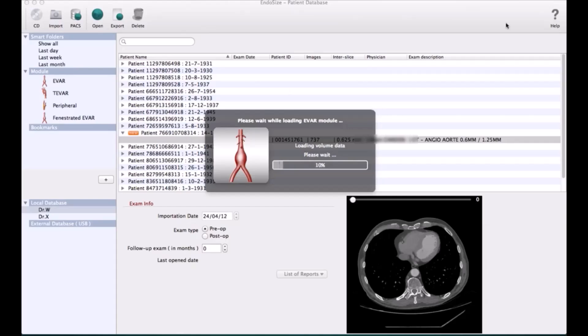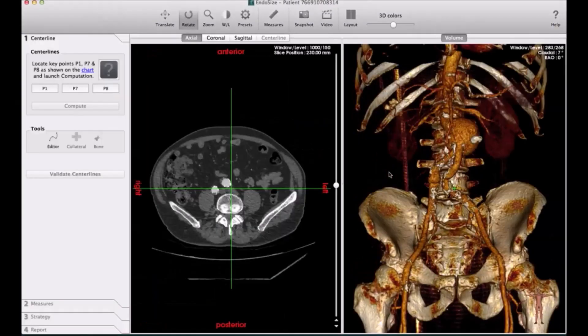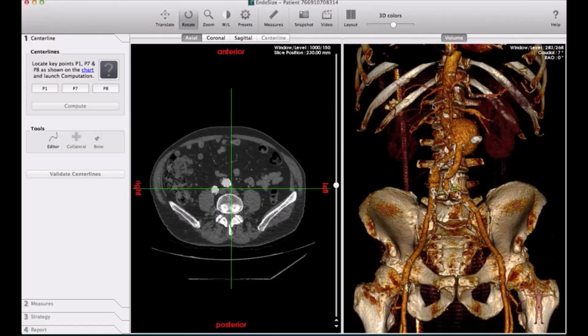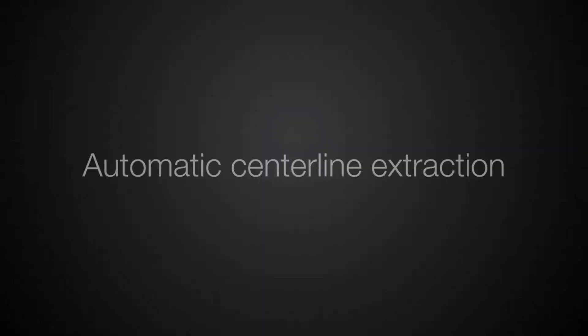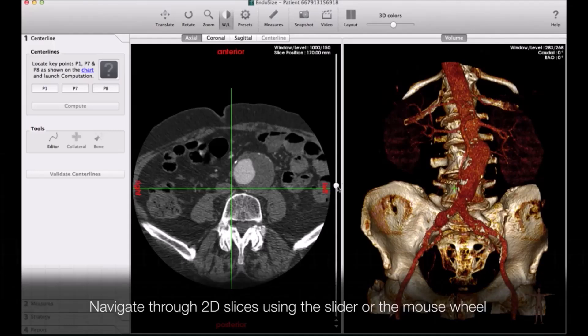It will ask you to put first three points: P1 area of the aorta above the renal, and P7 and P8, which is the right common femoral artery and left. It will do automatic centerline measurement, and this is very important.